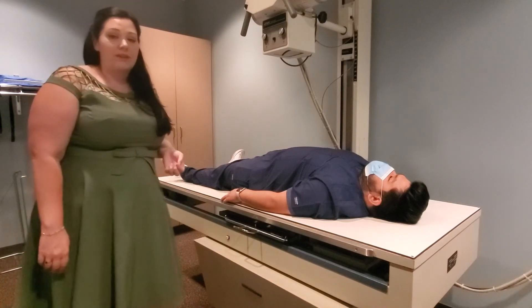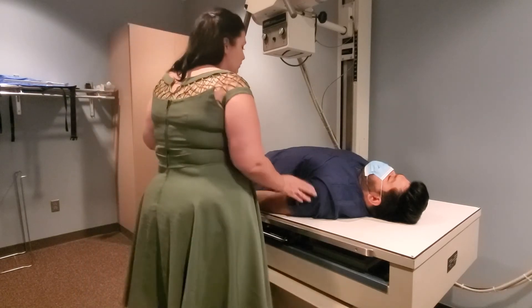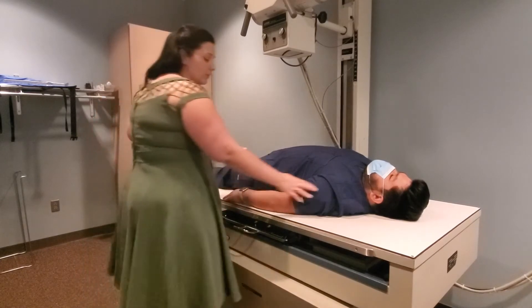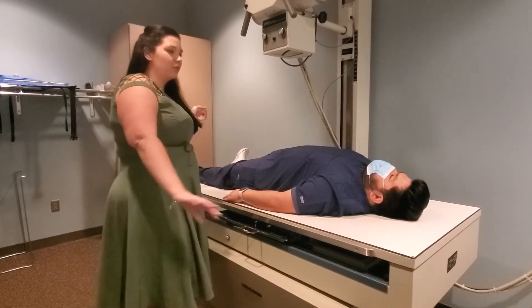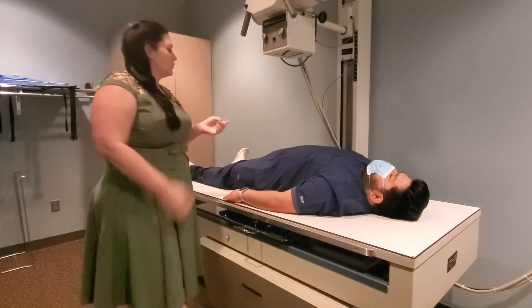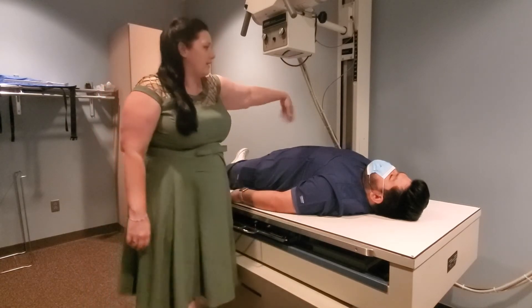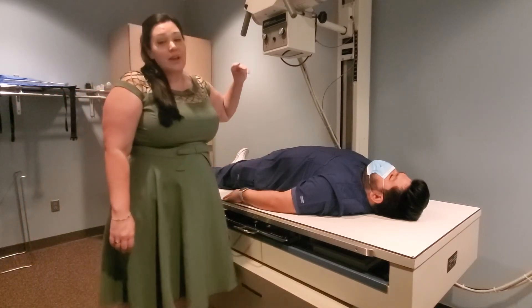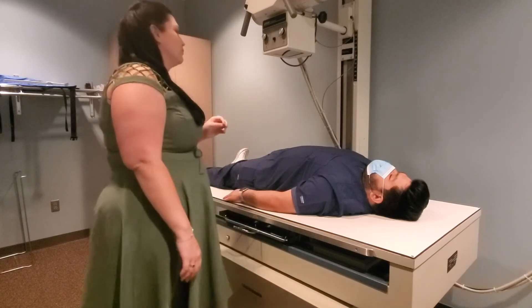Have the patient scoot about two or three inches to give a little more room for the humerus since we'll be turning it every which way. Make sure they don't move far enough to risk rolling off the table. In the real world you'll often have overhead tubes, and patient safety is a priority.